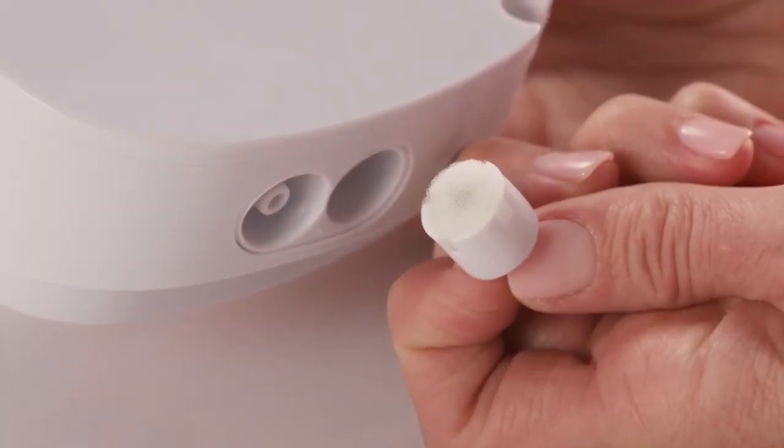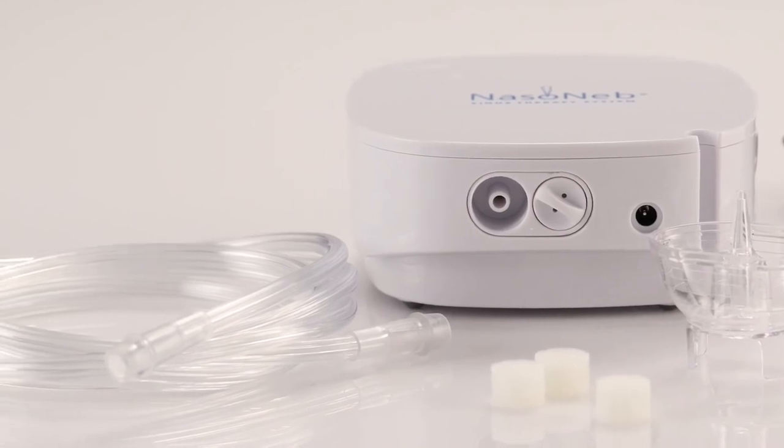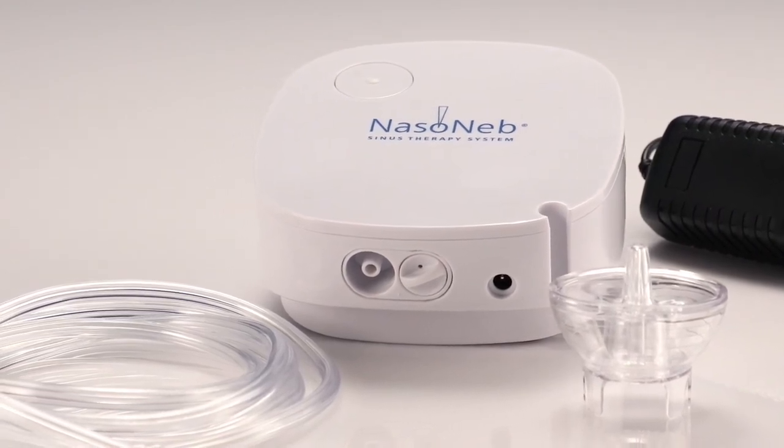The filter should be changed when it is discolored. Check it every six months. Replace the cup, insert, and tubing every six months. Thank you for taking the time to learn how to use and care for your Nasoneb Sinus Therapy System. Please refer to your instructions for use if you need additional information.